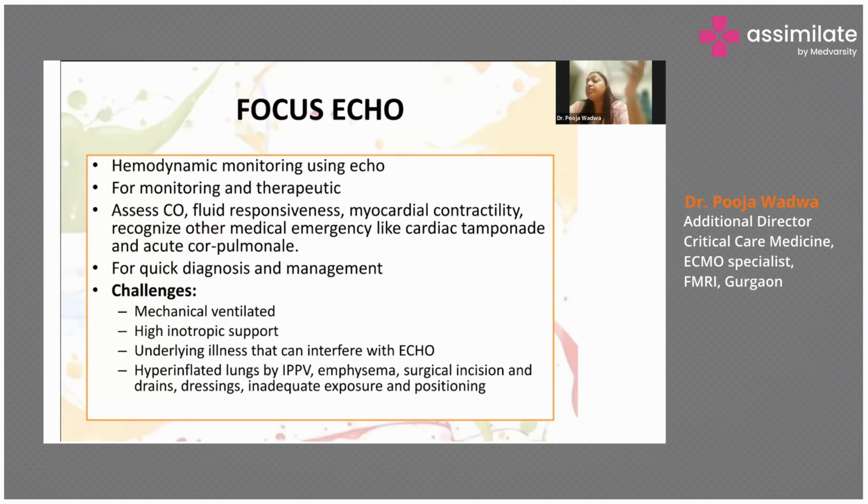Your patient may be on very high inotrope support, or mechanically ventilated, like we have all seen in COVID-19, where people went into ARDS and had high PEEP requirement. All these factors affect what you find in echo, which may not be pathological. We'll see in further slides how these challenges can be overcome to a certain extent.